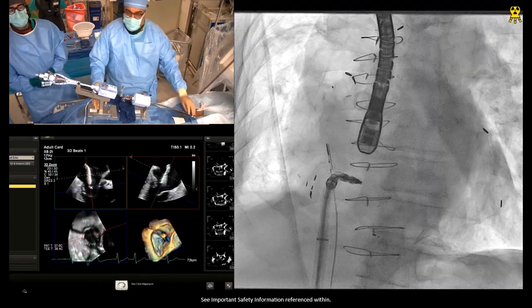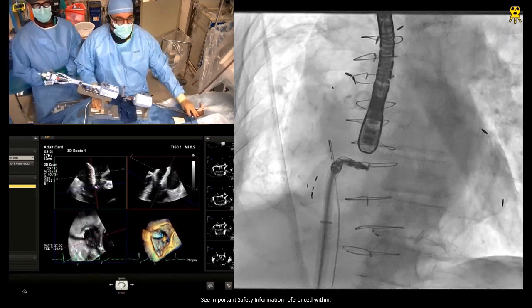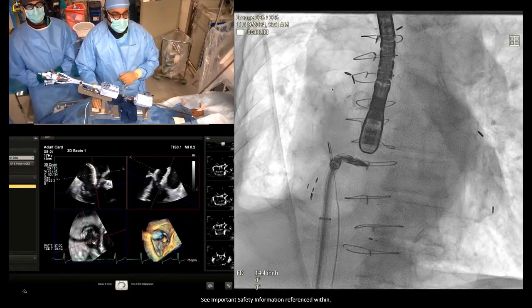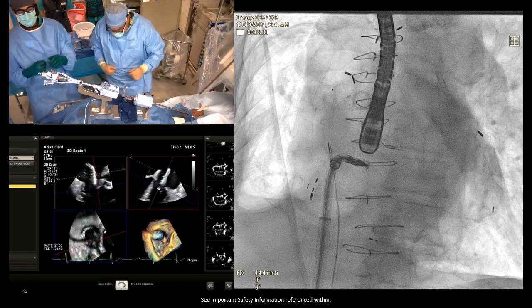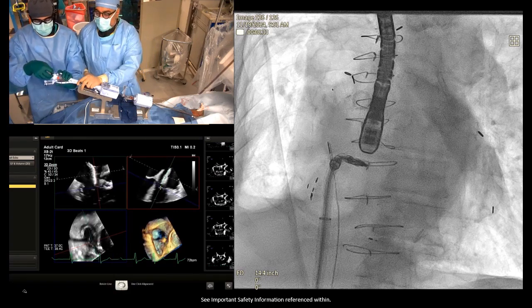So I'm actually going to push the stabilizer in. We're going to go ahead and push the stabilizer in, move more aortic. And how does that look right there? That looks like a great location. You're probably more mid-SA here. You can kind of see here in the transgastric-ish view. You're right there. Perfect. So I think at this point, what Akshay is going to do, he's going to open up the clip arms. And we're not going to open them up all the way.